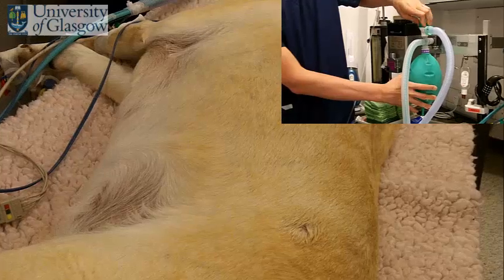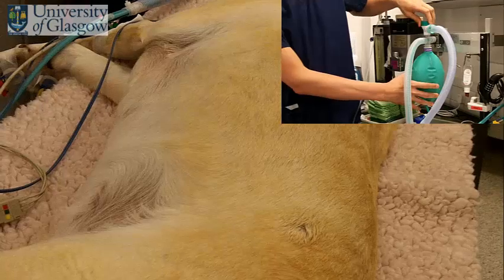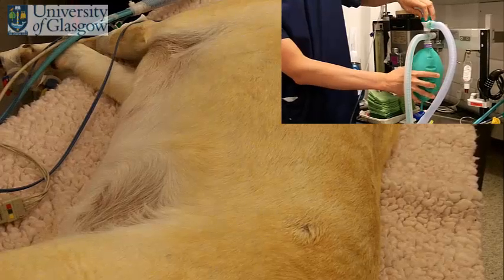What we're looking for with the ventilation is just a really modest chest rise, just slightly more than you'd expect to see if the dog is breathing for itself. We don't need anything exaggerated, just a reasonably normal physiological chest rise.